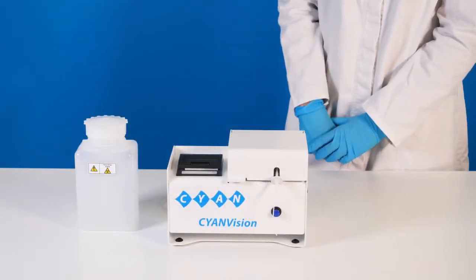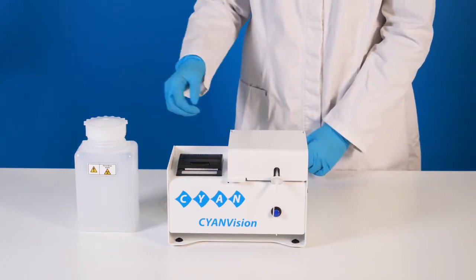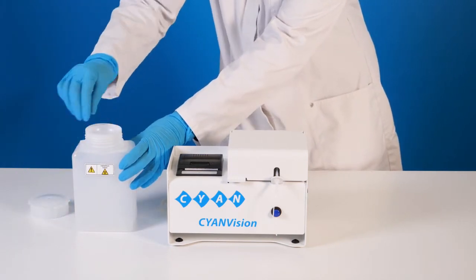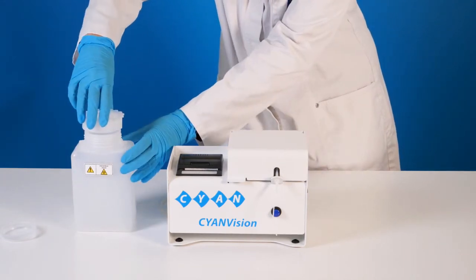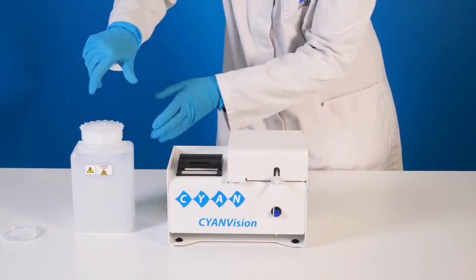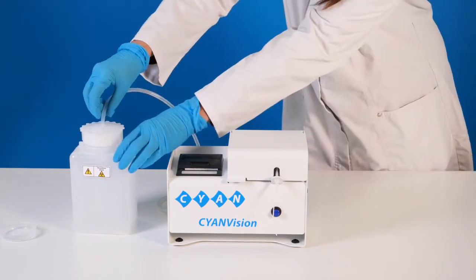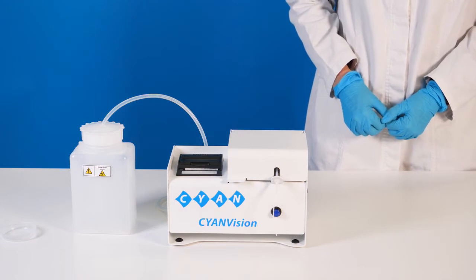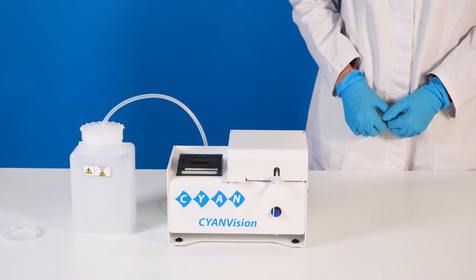The waste is collected in a separate container, which is delivered with the instrument. To install the waste bottle, first remove the external and then the internal cap of the waste bottle. Keep this internal cap — it can be used when cleaning the waste bottle. Screw the external cap back on, and slide the waste tube through the hole in the external cap. Insert the tube deep enough to avoid it slipping out during measurements. Disposal of the waste must be done in compliance with local regulations.